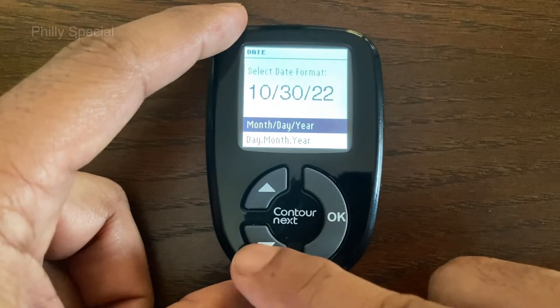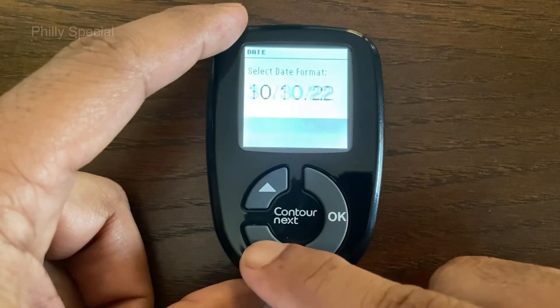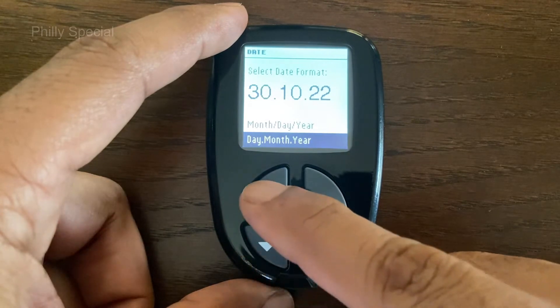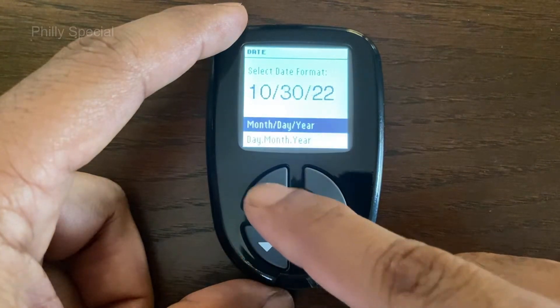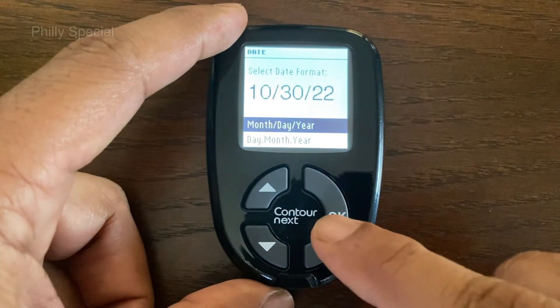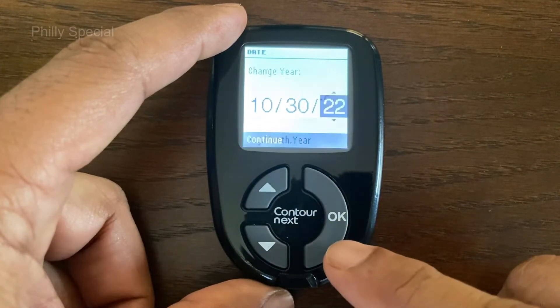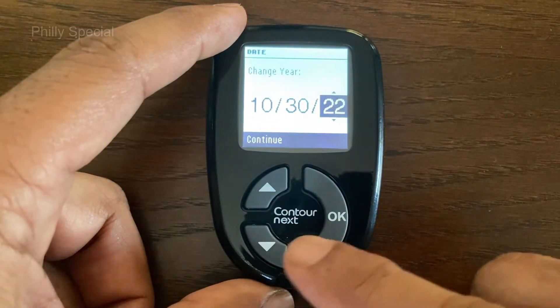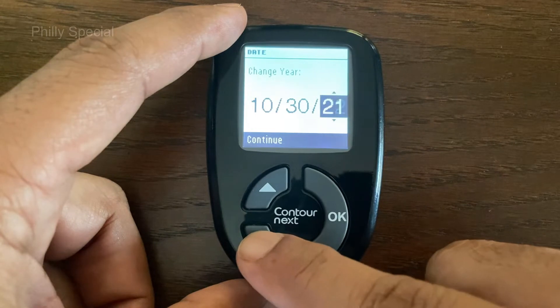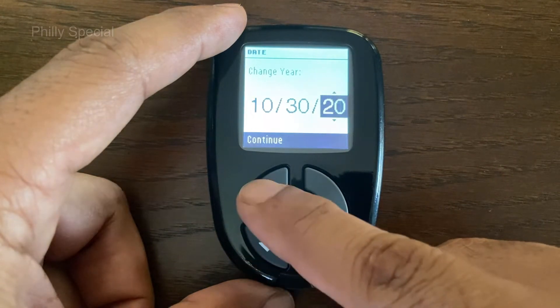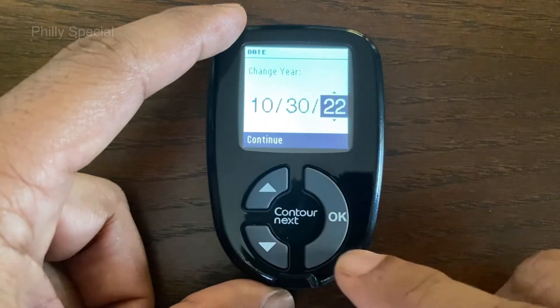Select the month, day, year or day, month, year format and press OK. The year is highlighted next; using the arrow buttons change the year and press OK to confirm.